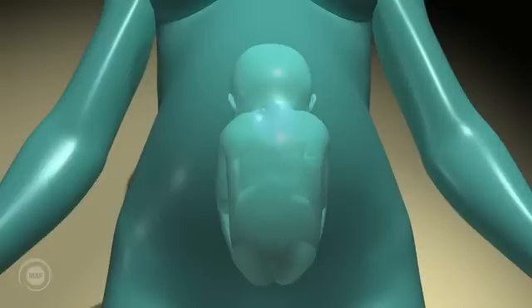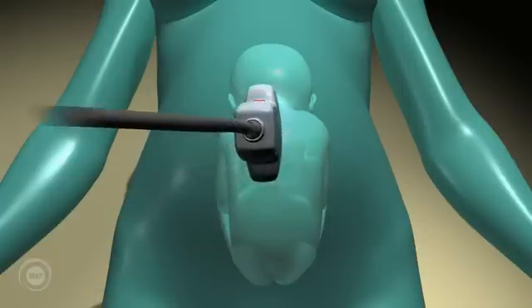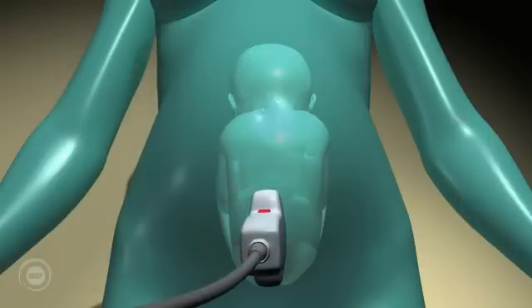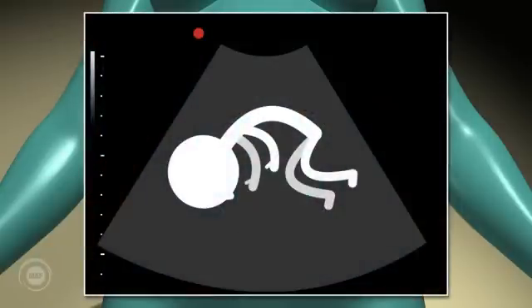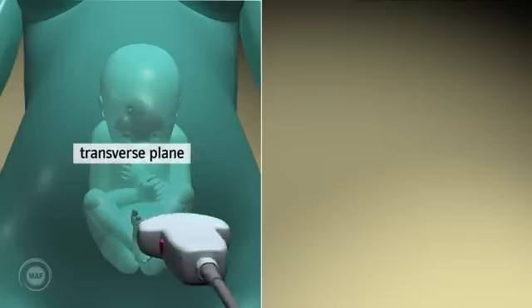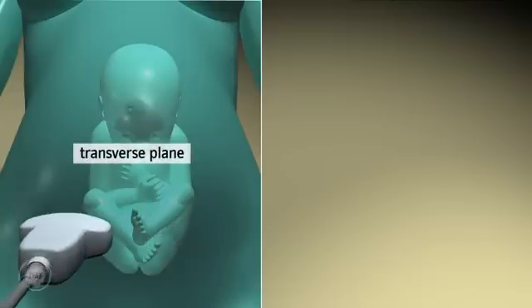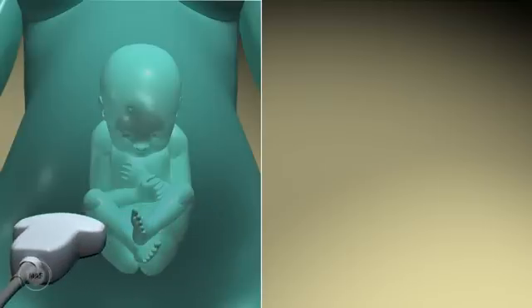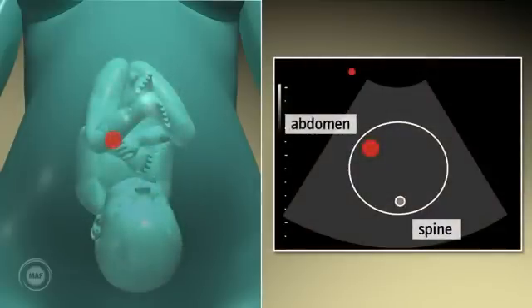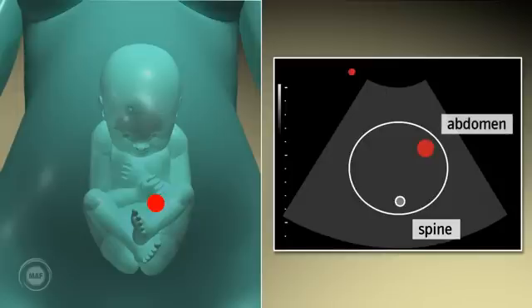Breech. It is essential to identify a breech presentation before delivery. Regarding the spine position, the same principles apply. For example, back anterior: scanning in the longitudinal plane, the fetus's spine will lie just under the mother's abdominal wall. The head will be to the left and the fetus's back will lie at the top of the screen. A good way to distinguish a breech presentation from a cephalic presentation is by scanning the fetus's abdomen in the transverse plane. With the back posterior, a cephalic presentation will always show the fetal stomach to the left of the screen, and with a breech presentation, the fetal stomach will always be on the right of the screen.